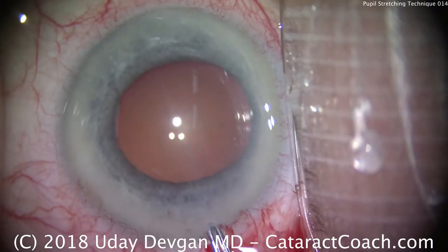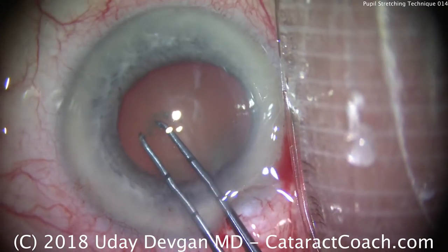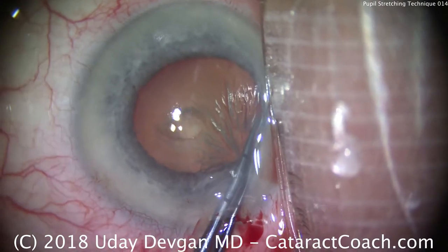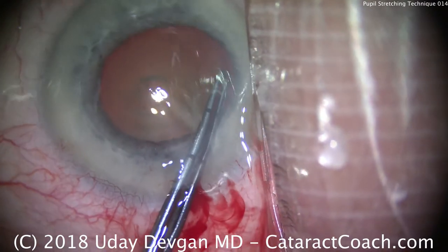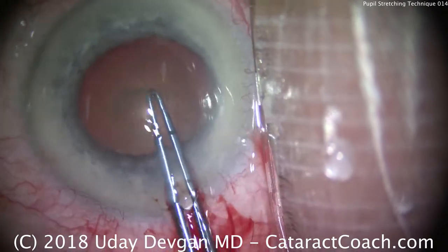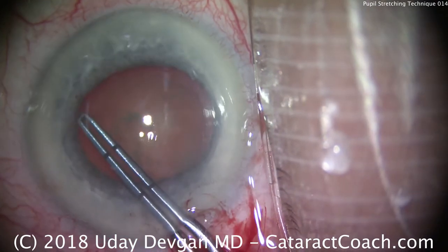We'll use our capsulorhexis forceps to poke into the anterior lens capsule and then tear our capsulorhexis. The forceps are marked off from the tips — 2.5mm and then 5mm back — so we can accurately judge the size of the capsulorhexis as we're tearing it. Just taking our time to make a nice, round, continuous, curvilinear capsulorhexis. Important in these cases: the viscoelastic, once removed, will allow the pupil to become a little smaller. So even though this looks like a good 5 or 6mm dilation, that's temporary. We're tearing a generous capsulorhexis — looks like we're going a little bigger than 5mm. And that looks great.